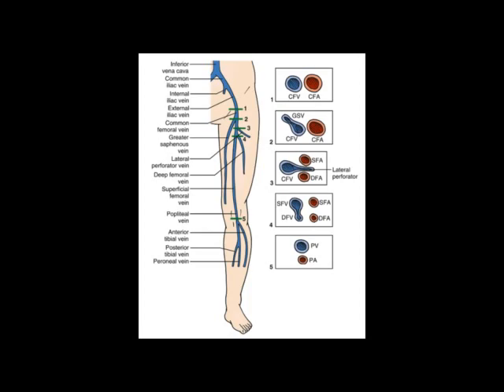Scanning and compressing every one to two centimeters, the next key point is where the greater saphenous vein takes off from the common femoral vein. It almost looks like a little bleb coming off the superomedial side — almost at a 10 to 11 o'clock position of the common femoral vein — again sitting medial to the common femoral artery.